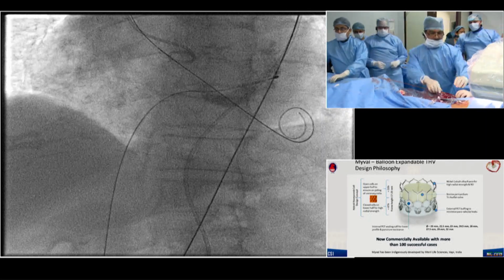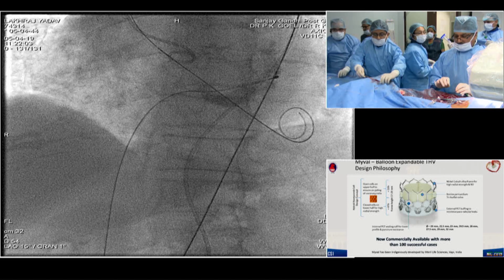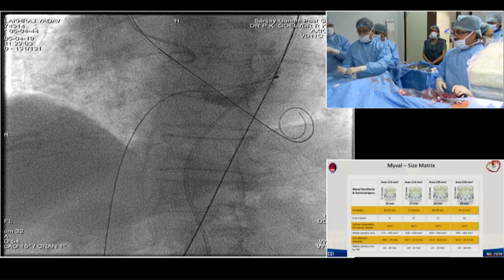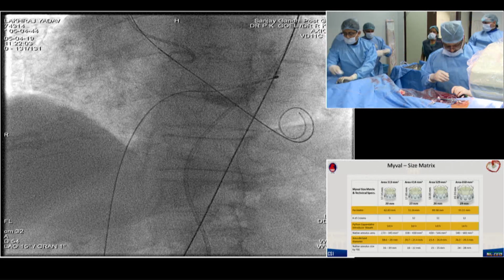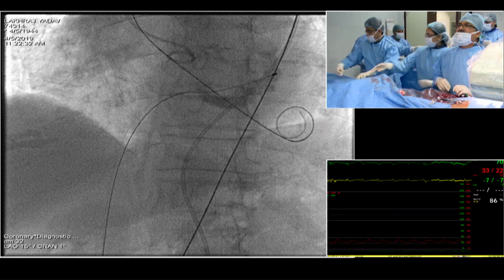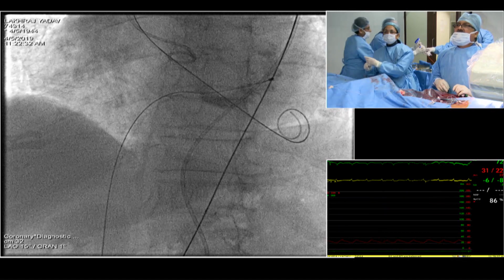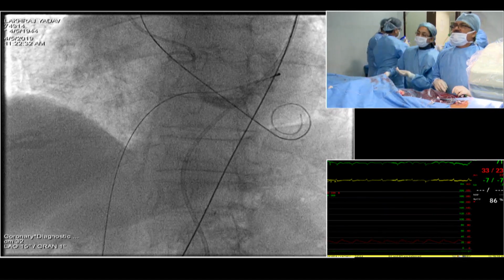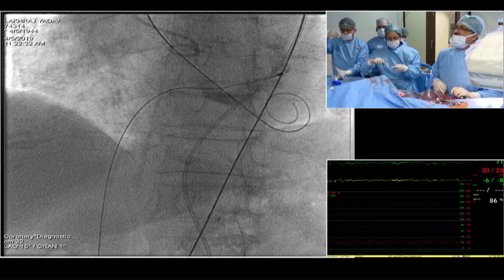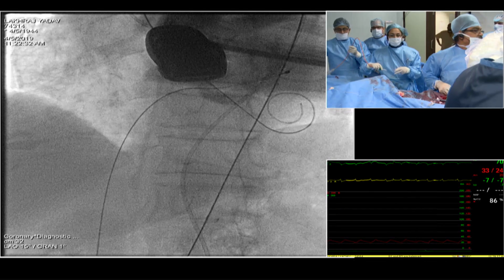Okay, leave it. I think you need to give some noradrenaline. The two concerns for sudden hypotension would be pericardial effusion, or the mitral valve apparatus being disturbed by the wire. Look at the echo. If the patient is not responding to atropine, I think it would be wise to do an echo to see whether there is some effusion and tamponade. Yeah. Fluoro, echo please.